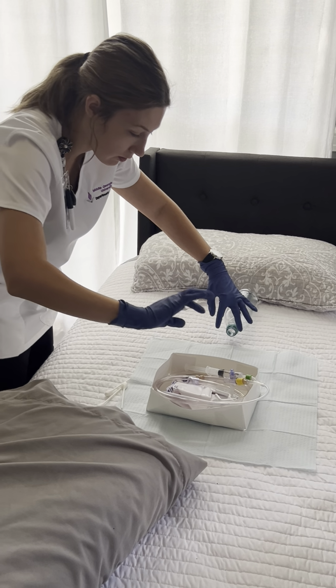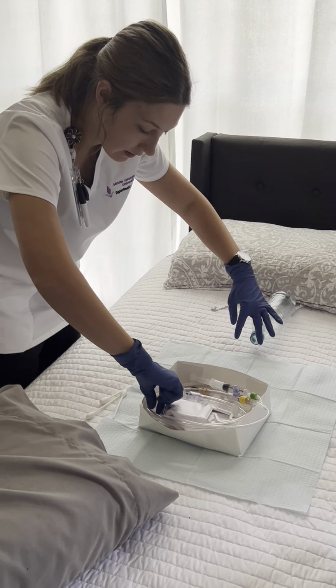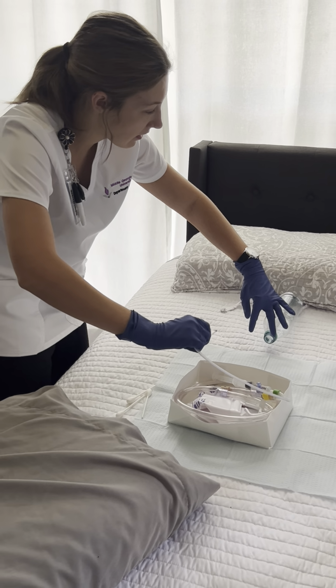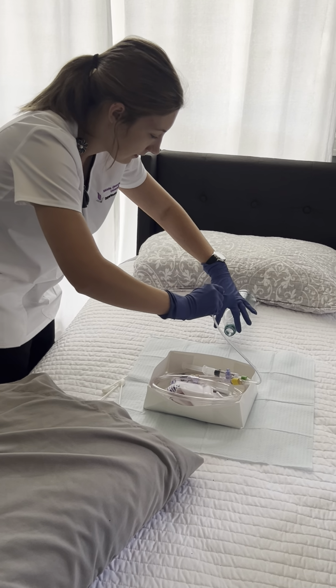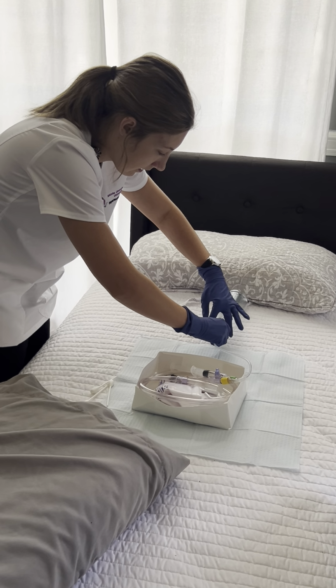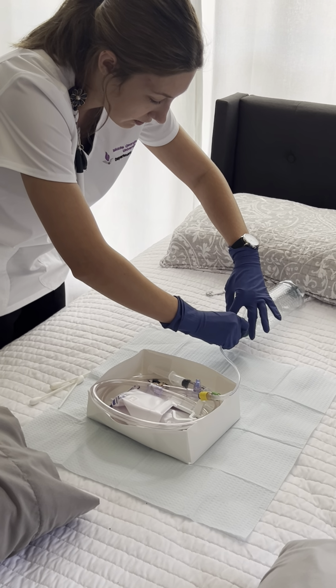Now I'm going to insert my lubricated Foley. So Miss Smith, I want you to bear down and take a deep breath. You're going to feel some discomfort, okay? And 1, 2, 3. Right. I'm seeing urine, so I'm going to go 1 to 2 more inches.